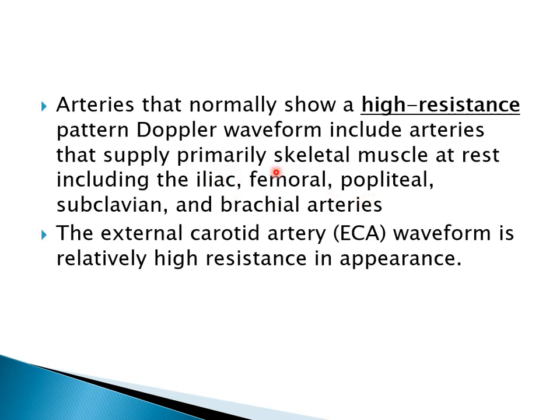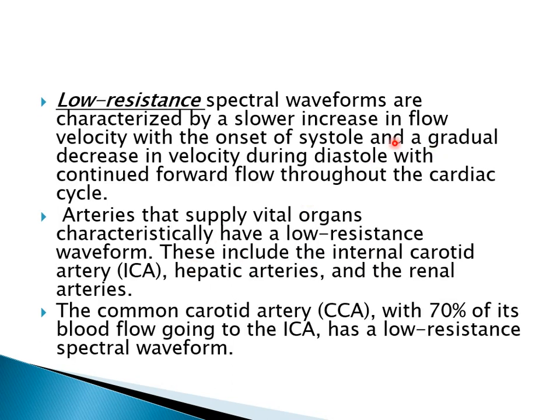The high resistance pattern is seen in arteries supplying skeletal muscle, like the iliac, femoral, popliteal, subclavian, and brachial arteries. The external carotid artery is relatively high resistance. Low resistance is also seen in the vital organs, and the common carotid artery, with 70% of its blood flow going to the internal carotid, also has low resistance blood flow.